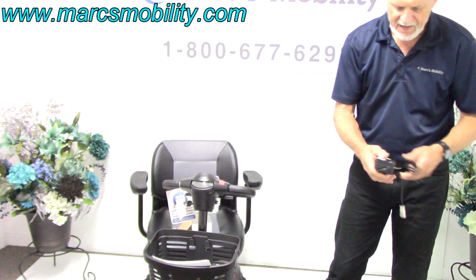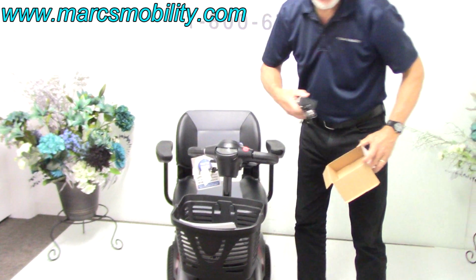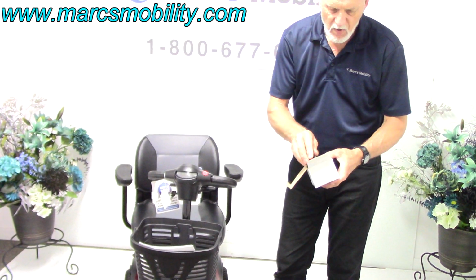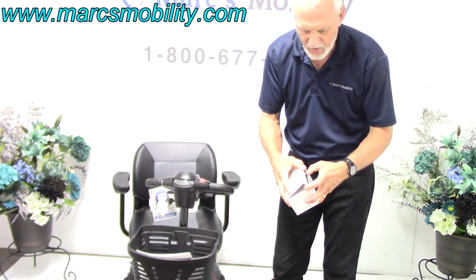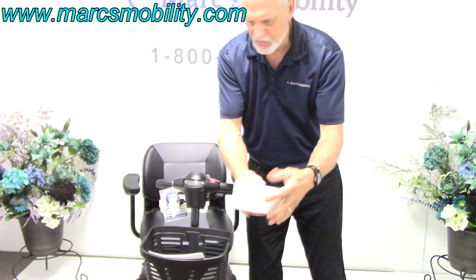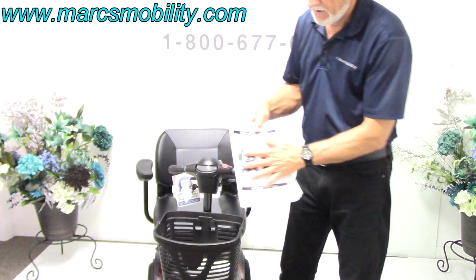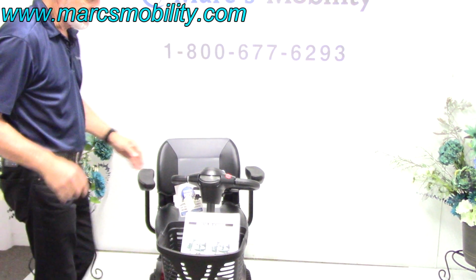So I tell a lot of people, keep your charger with you if you happen to go somewhere and you've used it all day long and the batteries are getting low. While you're eating, plug it in for an hour while you're eating, you'll get another 2 or 3 hours of riding time. The charger is so small, you can put it in the bottom of your basket. You have your owner's manual here.